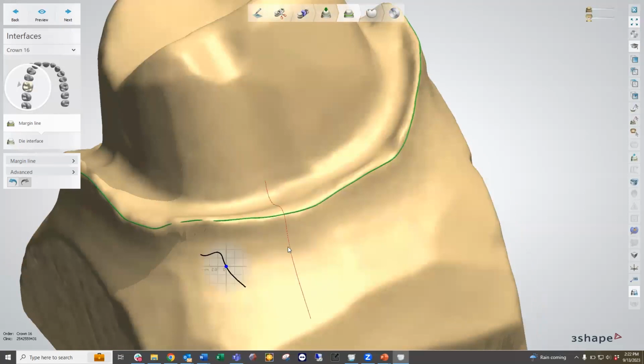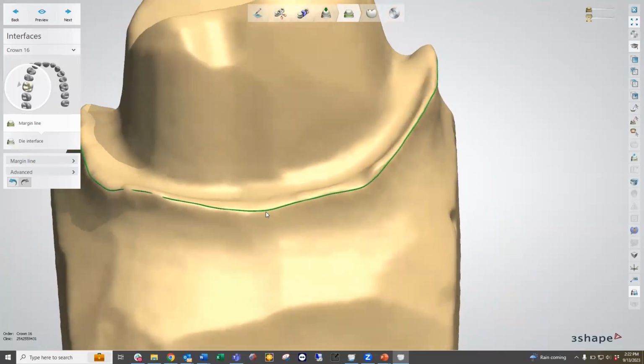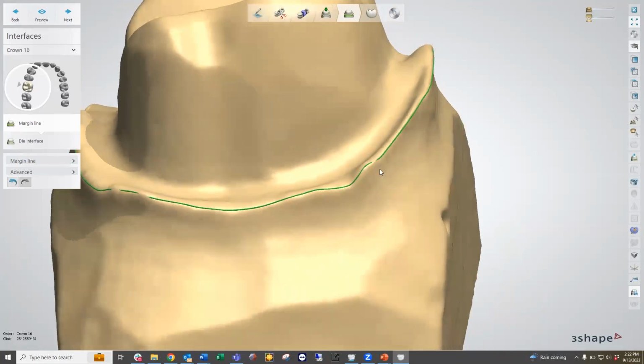Now, we do have options to get rid of that little cross-section screen if we don't like it. We can right-click on the green line, and we can remove the show local cross-section option. This allows us to just take a look at the screen as is, and we can see exactly where we want that margin to be and make some edits.